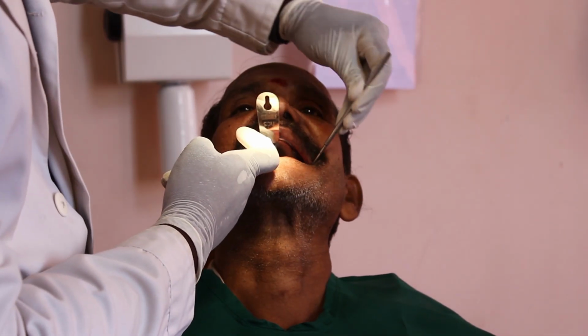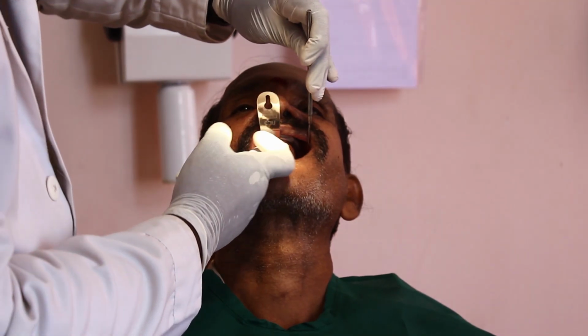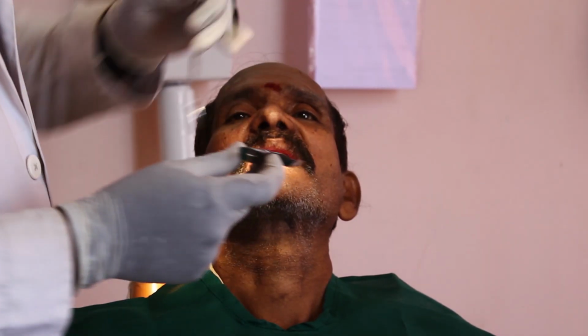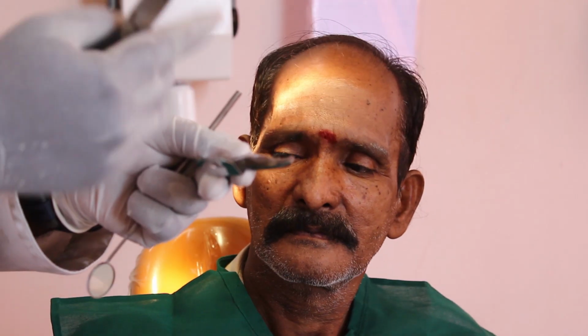So this tray is suitable for this patient. It's covering all the peripheral limits. In case there is any excess gap between the flange of the impression tray and the alveolar ridge, more than 5 mm, then using this universal plier, you can bend it and adapt it in the particular region wherever it is required. And in one more situation where there is an excess height of the flange, and it's impinging on the vestibule, then you can trim the excess as well.